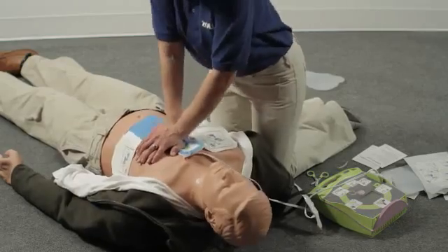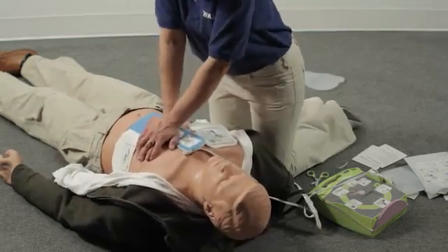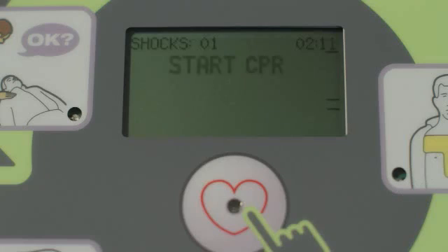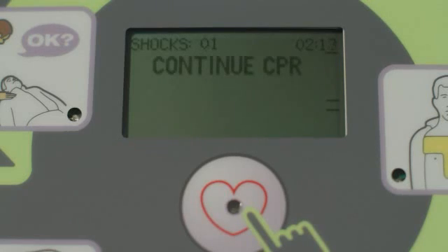If you don't start CPR right after being told to do so, you will be prompted every 10 seconds until you do start. And if you stop CPR longer than 10 seconds, the AED Plus will tell you to continue CPR every 10 seconds until you resume CPR. Continue CPR.